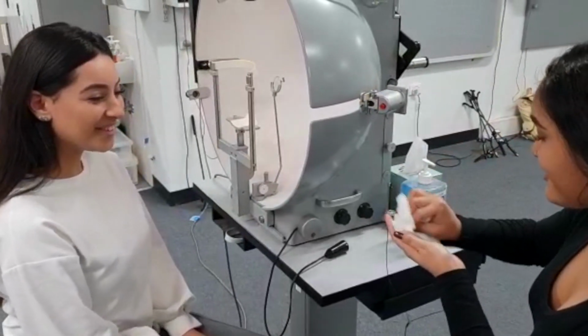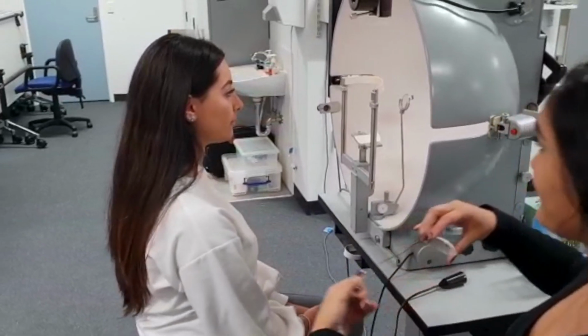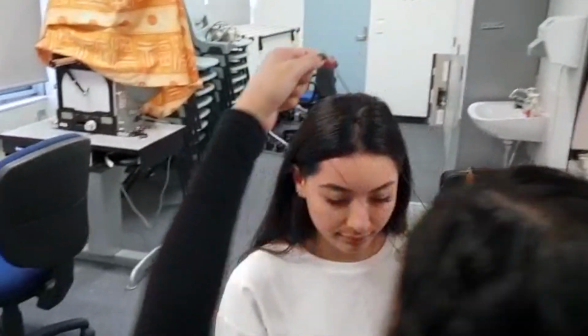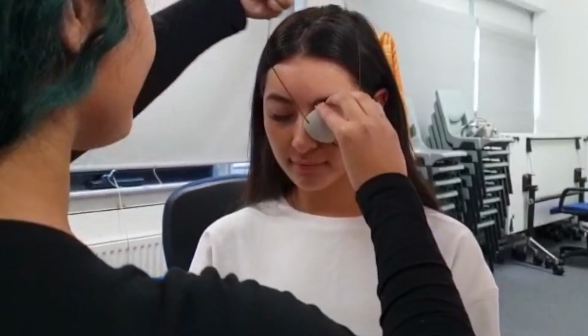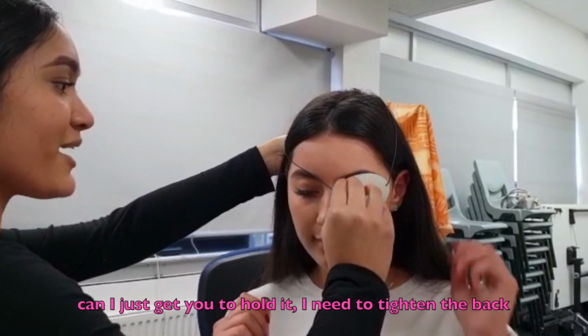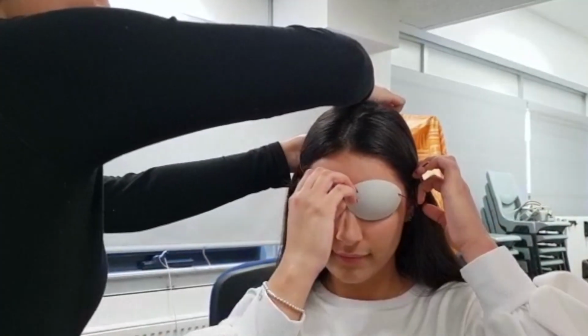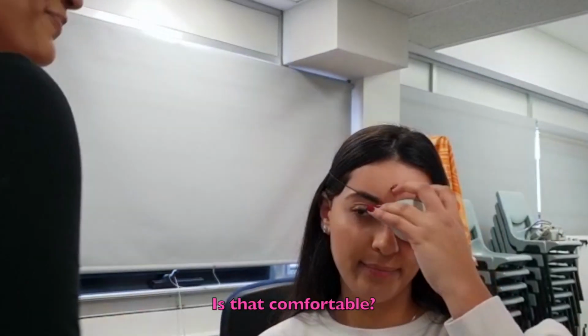Move up, down. And just keep looking at this eye patch on you. Just look over here. Yep. Is that comfortable for you? Yep.